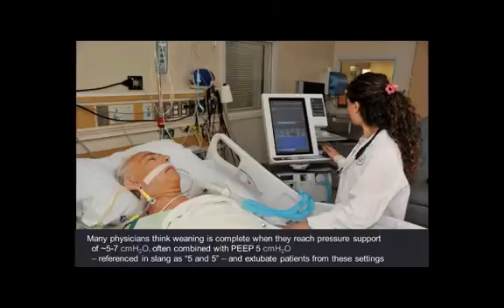So many physicians think that weaning is complete when they reach a pressure support of 5 or 7. And they'll often combine that with a PEEP of 5. And I think in the community, this is often referred to as 5 and 5. And people say this is how you wean people. And so once a patient reaches 5 and 5, the patient will be extubated from these settings. I believe that's extraordinarily dangerous.